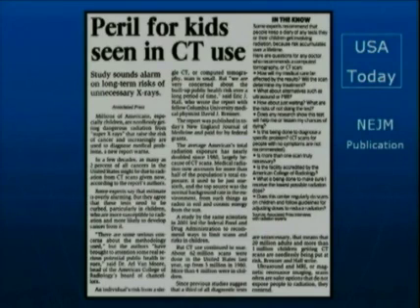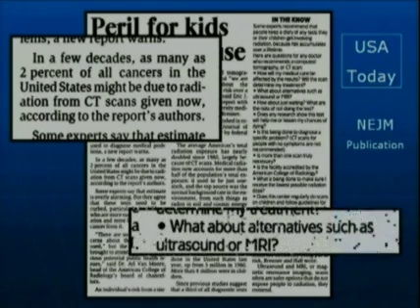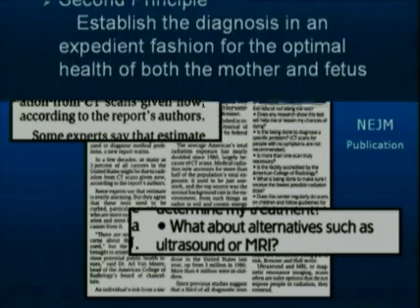Even the lay press, this is from USA Today, from an article in the New England Journal of Medicine, they again talk about CT scanners and say in a few decades 2% of all cancers in the U.S. may be due to radiation from CT. So what do they recommend? A lot of different things. One of the things they say, well, what about ultrasound or MRI, which I'm going to talk to you about.